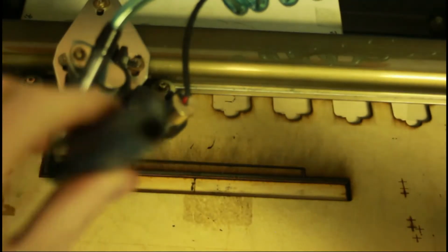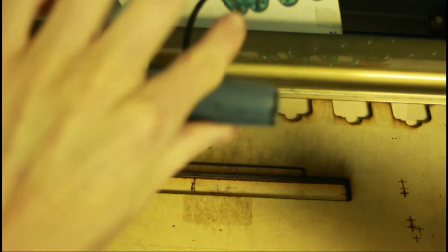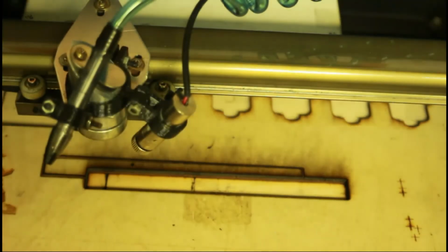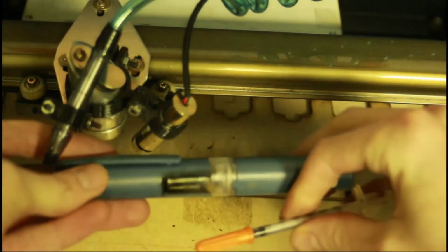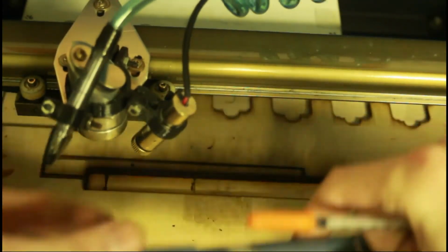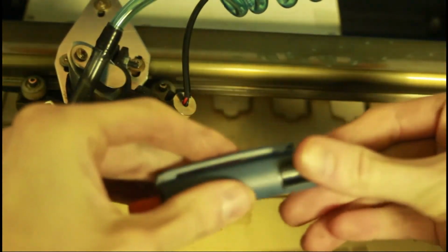After using the scraper to cut it off, there we have it. There's a hole in the pen cap. Now, let's see if we can make it work. Here I have the pen syringe fully done, and here I have a syringe. Let's try it out.